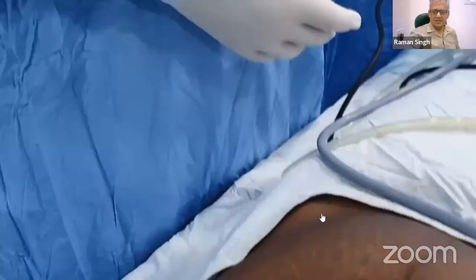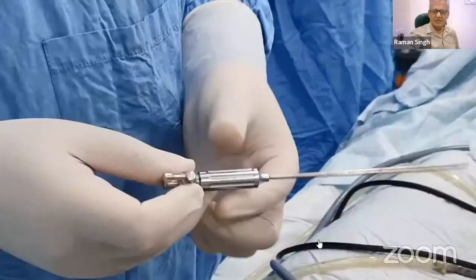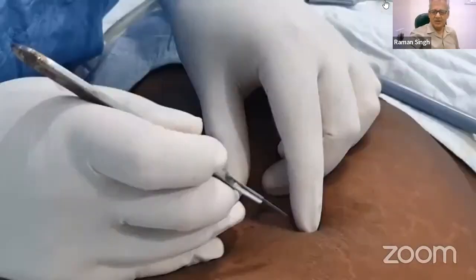When this white balance is done, now the surgeon is asking for the Veress needle, which is the first step of any abdominal surgery. Before introducing the Veress needle, he is checking whether the needle is working properly or not.